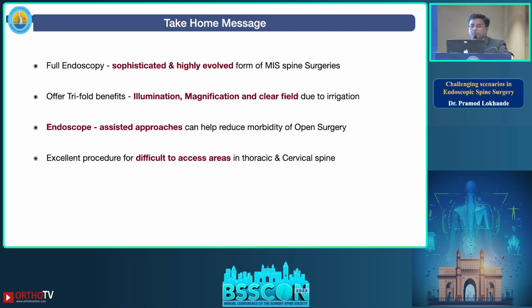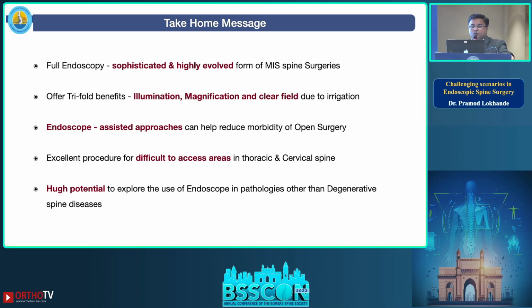And it is an excellent procedure to approach difficult to access areas, especially the cervicothoracic junction of the thoracic spine. And it has a huge potential to explore the use of endoscopy in pathologies other than degenerative spine diseases.